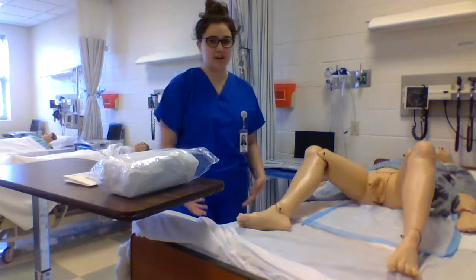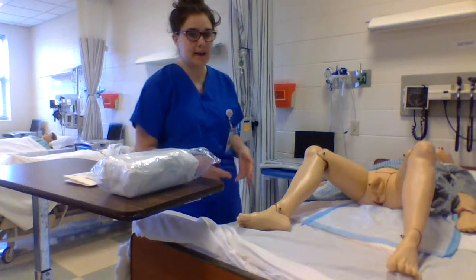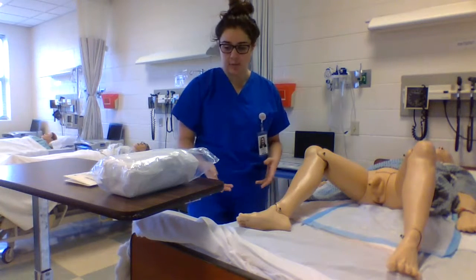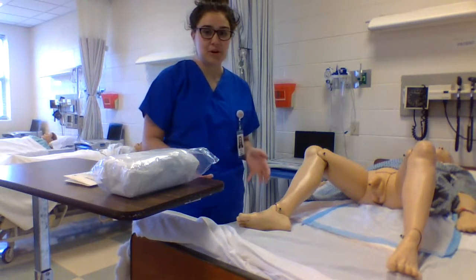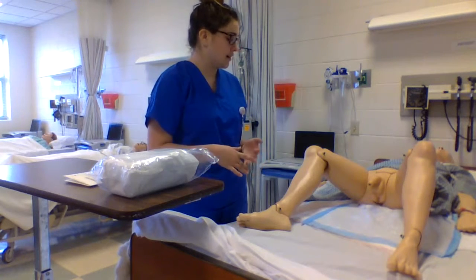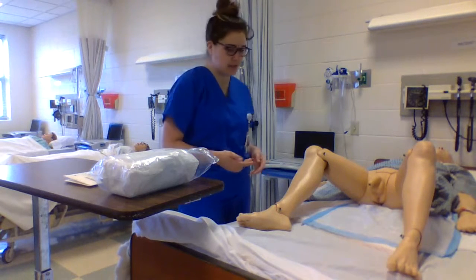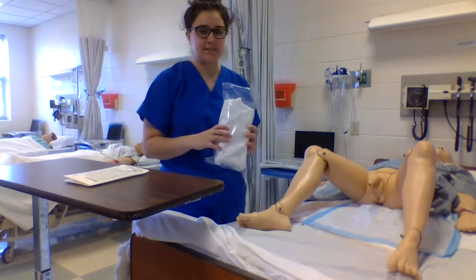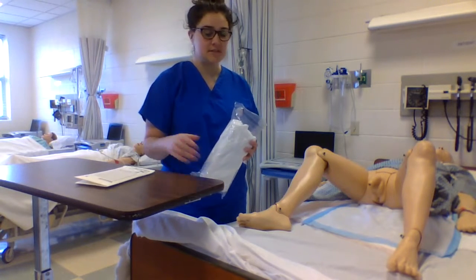So this is Mr. Jones. I've already raised his bed, gotten him into position, and put a blue pee pad or water absorbent pad underneath him. I'm going to wash my hands before I start the process, obviously. I'm going to provide pericare before I start, which I already have, with washcloth and gloves. I'm going to then get my sterile intact straight cath because I'm getting a urine culture from him, and some sterile gloves.